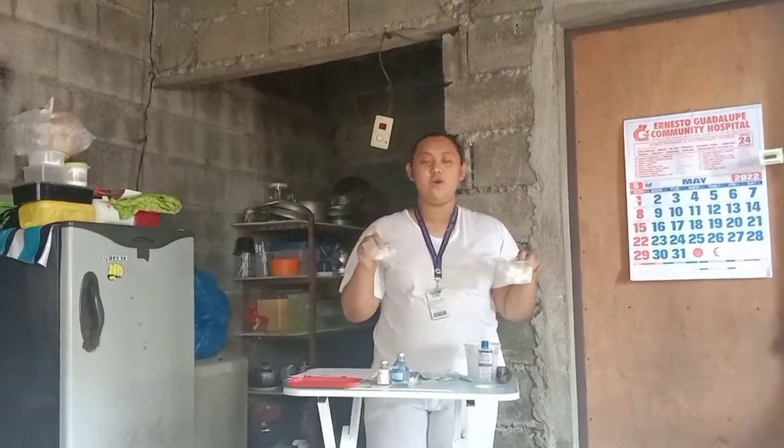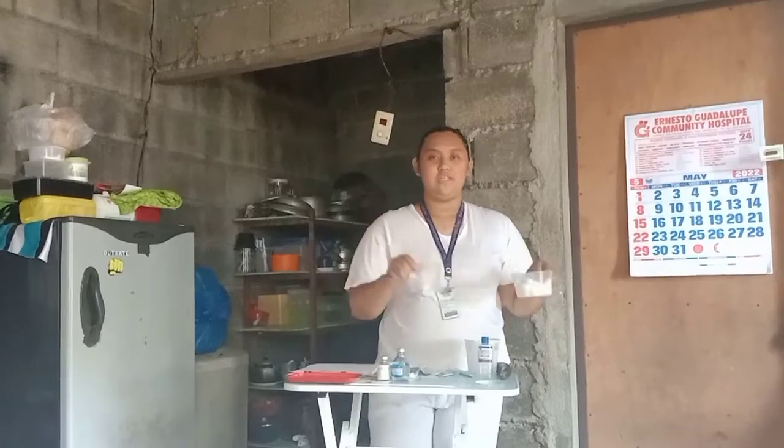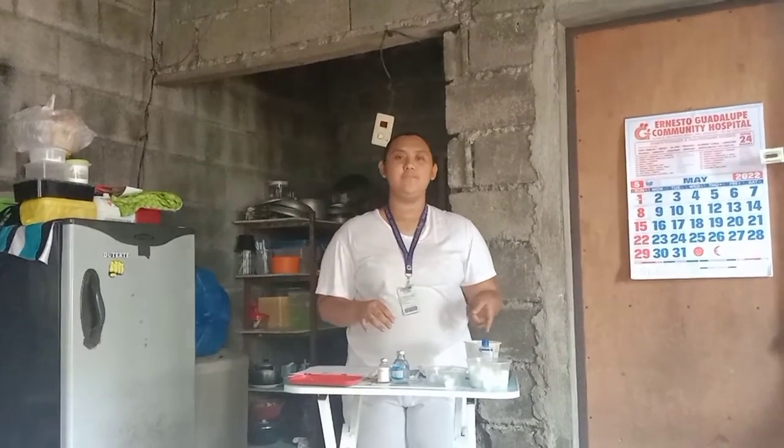I also have dry cotton balls and soft cotton balls with 70% alcohol, and forceps. And the most important is that I have the waste receptacles here. This is where I will dispose the used needles and syringes. So to prepare the medication for the intradermal injection, the first thing to do is open the tuberculin syringe, opening the sterile package only, touching only the barrel and the plunger to avoid contaminating the needle.